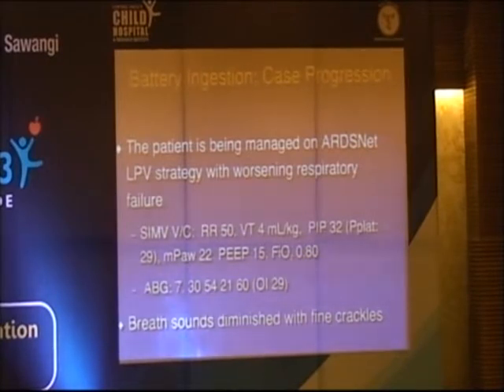There just have been 2 studies published in adults comparing conventional mechanical ventilation and oscillatory ventilation head-to-head with similar type of support, and there was no difference in terms of long-term outcomes, mortality. So we use the oscillator, we're familiar with it, but I think we're still afraid to use a PEEP like we probably should. Yeah, I agree completely and wholeheartedly.